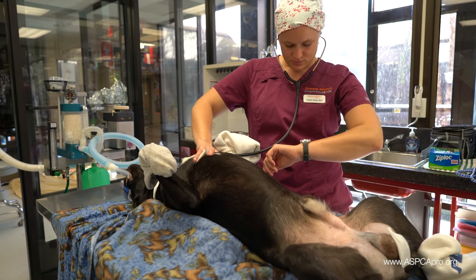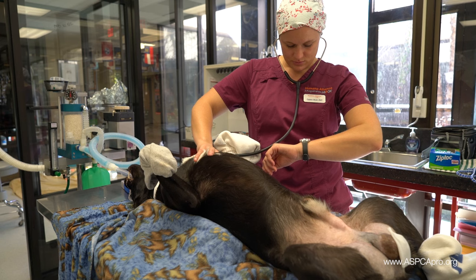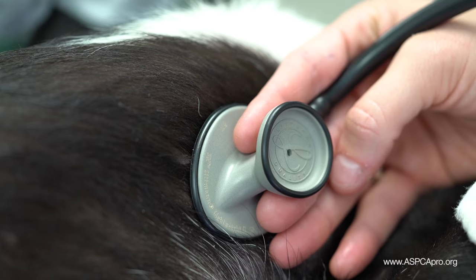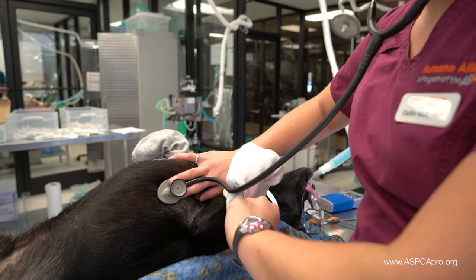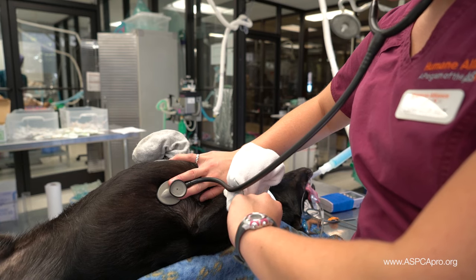Alternatively, use a stethoscope on the chest to auscultate the heartbeat. Count the number of beats that occur over 15 seconds and multiply by four in order to get the rate in beats per minute.